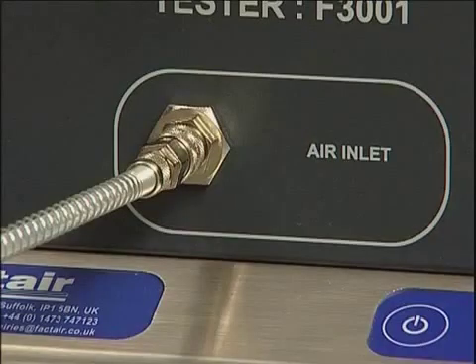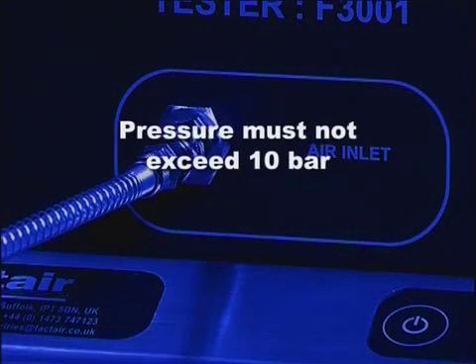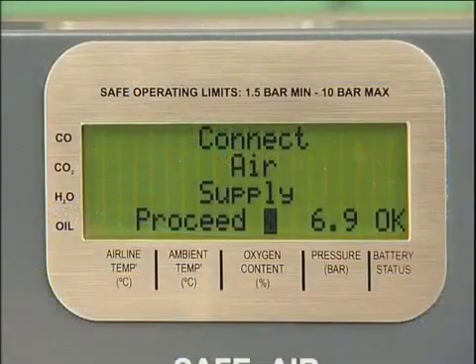The pressure displayed on the tester will be that of the regulated supply from the cylinder and must not exceed 10 bar. Please note that if the unit is over-pressurised, it will automatically shut down and display an over-pressure warning. It will then need to be returned to the manufacturer for checking and resetting. Press Enter.